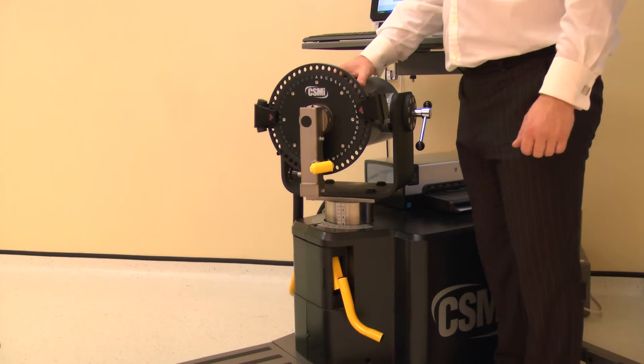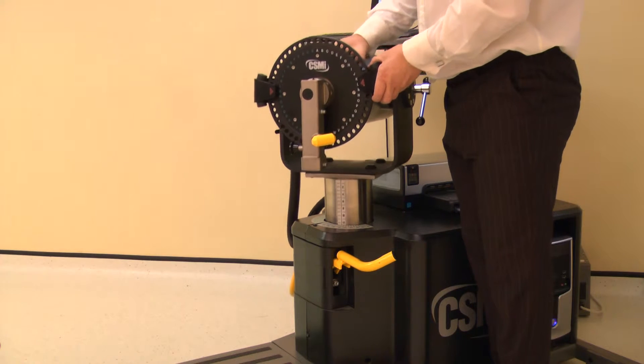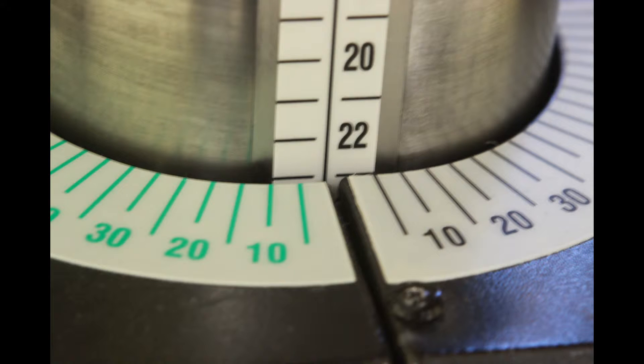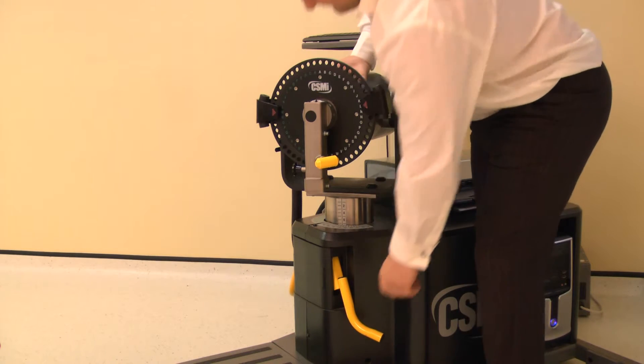The dynamometer height and rotation are adjusted together. Lift the locking handle to release. Rotate the dynamometer to 0 degrees whilst also adjusting the height to 23. Ensure both locking handles are pushed down to secure.